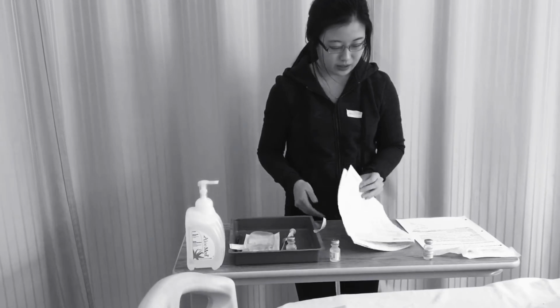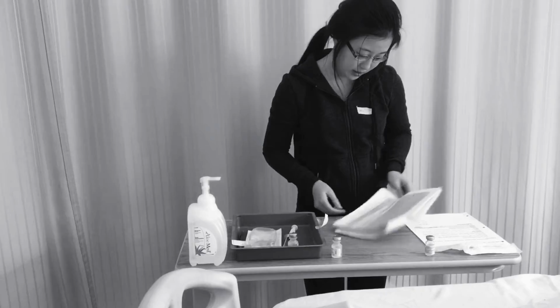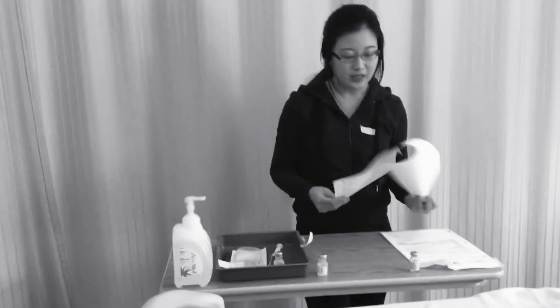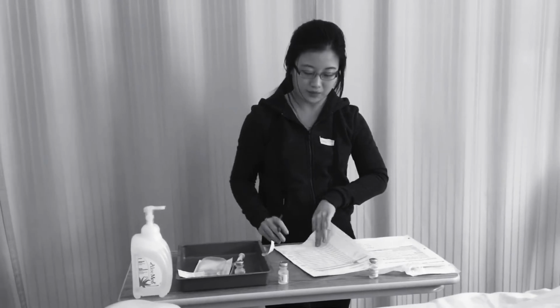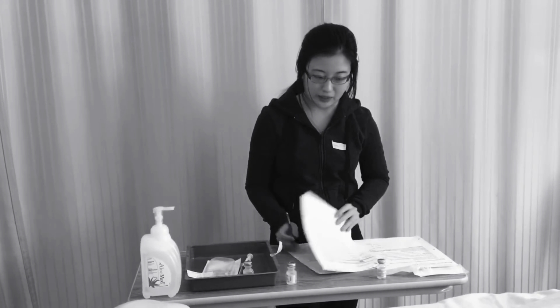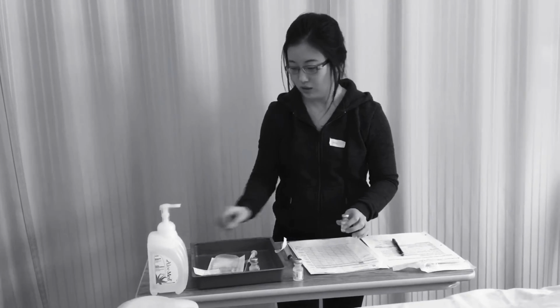Okay, and now I need to see how much I need to add for the CIVA pump. So it says I need a 10 ml syringe, and I need 10 mLs in total. So I'm going to do my calculation. I need 200 mgs. There's 250 in the vial. So I'm going to cross multiply, and I get 1.6 ml that I need to take out from there. So I'm going to take that out.